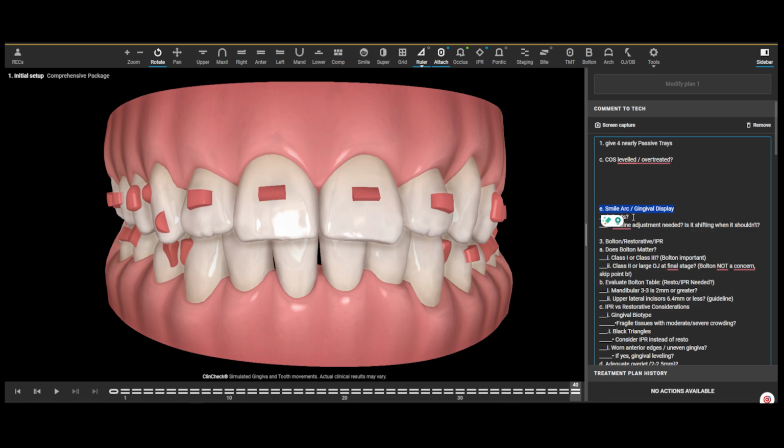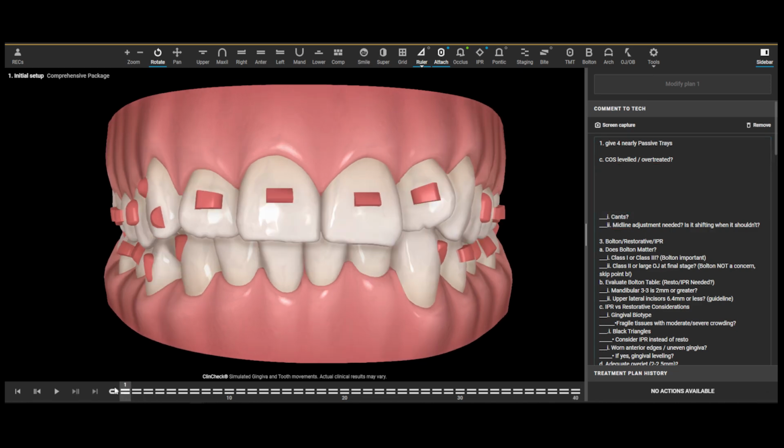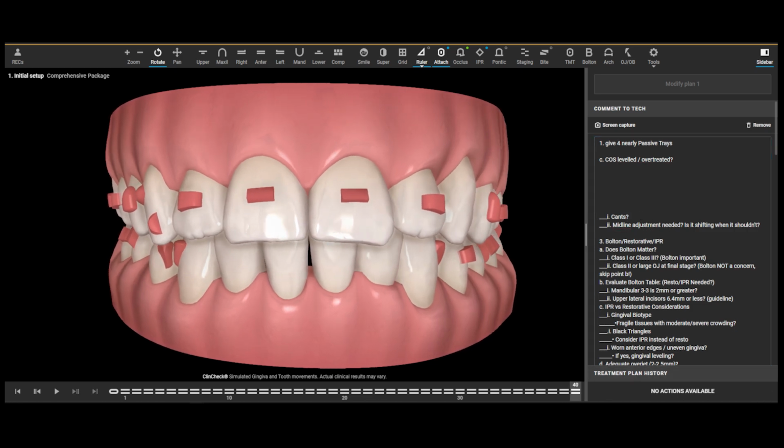So is there a cant? Yes. Do we need to make adjustments on that? Yes, we need to go ahead and we probably need to intrude those teeth a little bit more even. Is there a midline shift needed?